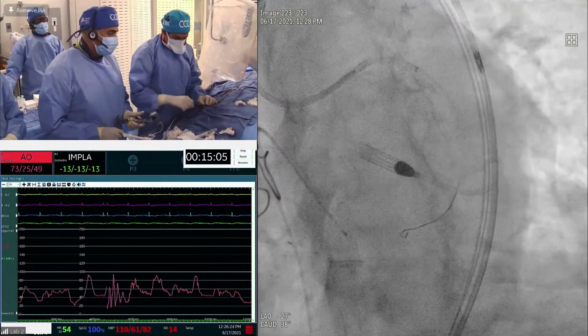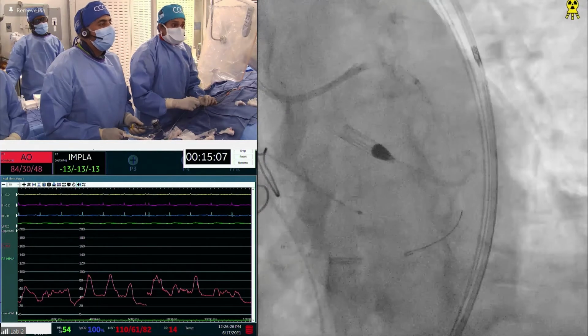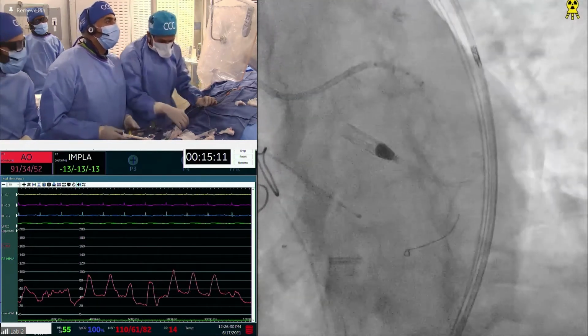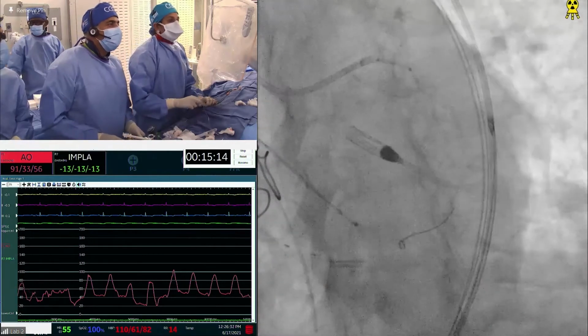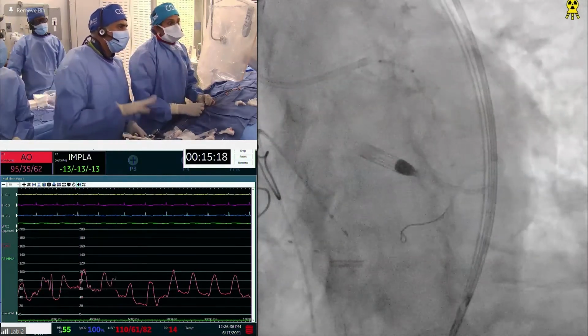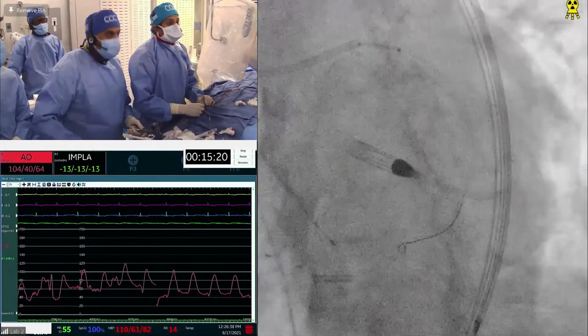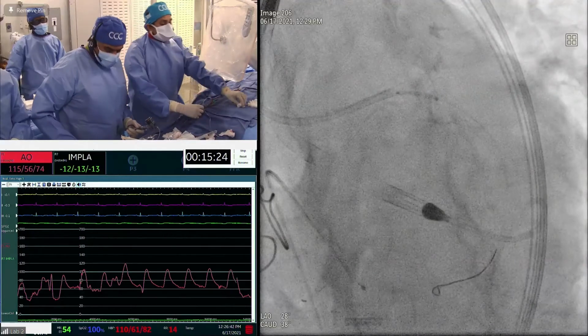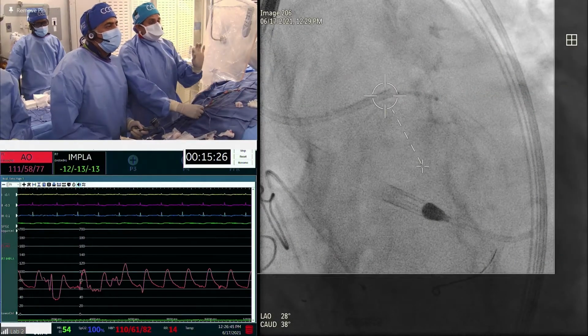Again, we need the Godzilla. Now, do you see that? Yeah, exactly. This is amazing. It's short. Can you hear me? 3.5 by 4, short. Do you guys worry when the stent is there, you bring in a Godzilla, like 8 or 10 millimeters? Aren't you worried that you could completely overwhelm the stent? Sometimes accordion the stent, right? Well, the interesting point, Roxana, yeah, sometimes it causes deformation.